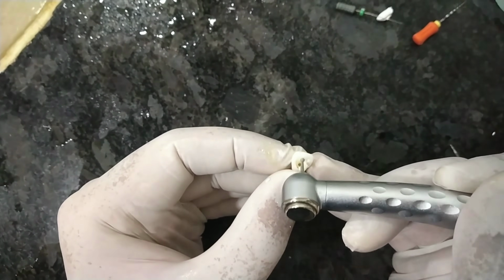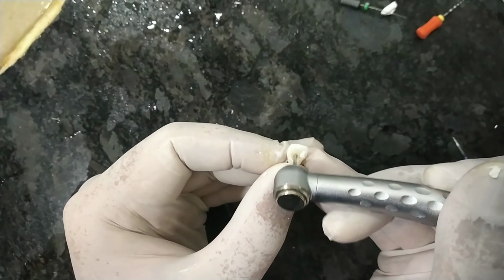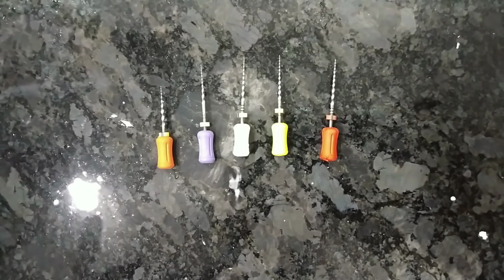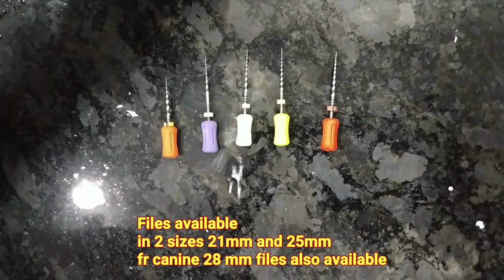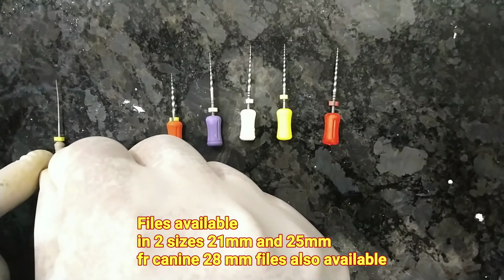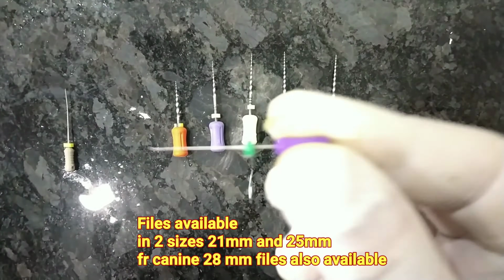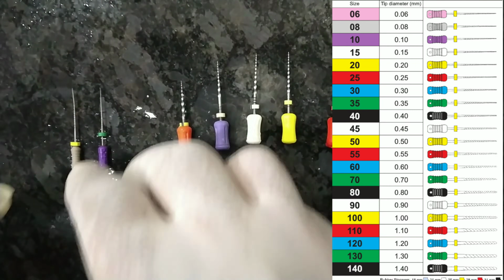You can see here, the dentin on the sides, we have to remove, and the upper part also. Just for a quick revision, I'll show you the file sequence. This is the number 8 file which I use in the beginning for canal exploration. Then this is the purple color file, the number 10 file, which I use for canal exploration.